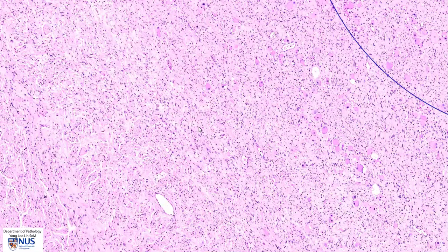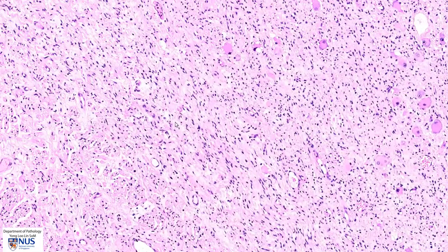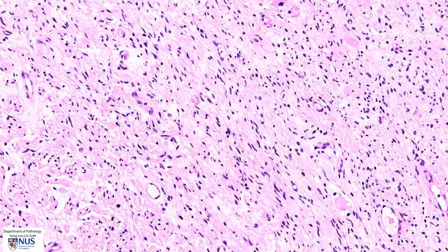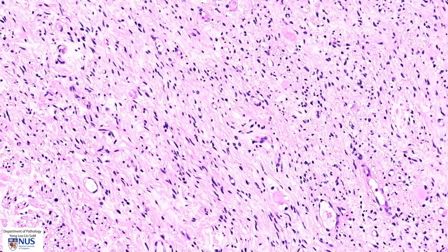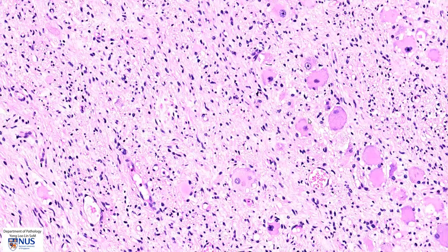In summary, this is an example of a ganglioneuroma showing the neuroma component, which is composed of spindle, elongated slender Schwann cells arranged in parallel bundles or fascicles, and also ganglion cells, which are very obvious because they are large polygonal, have abundant cytoplasm, and large round nuclei. This is a benign neoplasm.